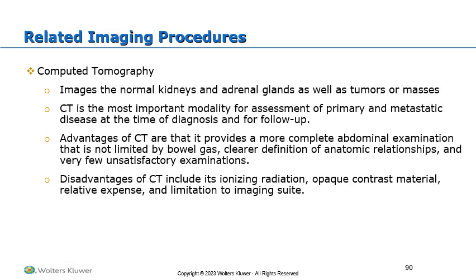That brings us to CT, which provides us excellent global images. So where we may be having to focus on one little thing at a time in sonography and working through windows, working so hard, CT can zip through anatomy. It's fast. It's available most places. And it can give a good global view.